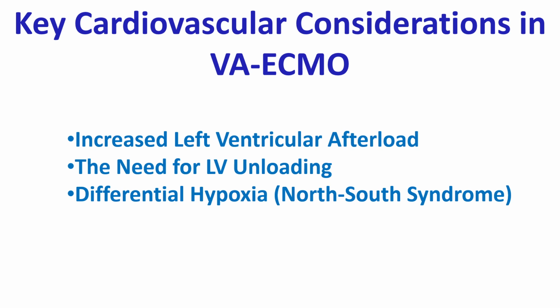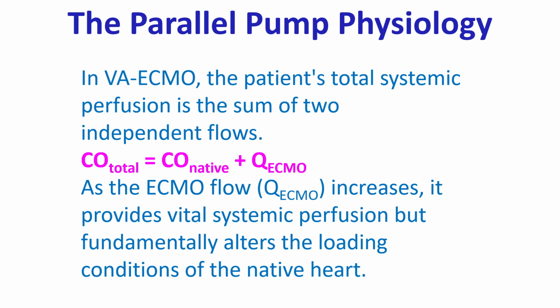to the lower body. Understanding the hemodynamics of VA ECMO requires shifting from standard physiological models to evaluating two parallel circulations competing within the same vascular bed. This transforms the cardiovascular system into a battle of physics between the native heart and the centrifugal pump.